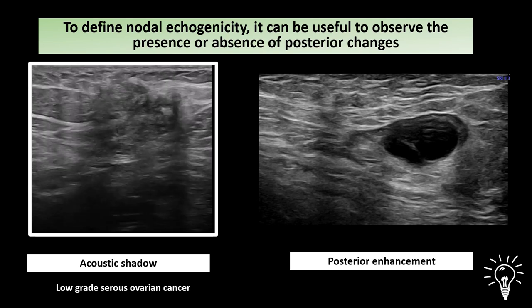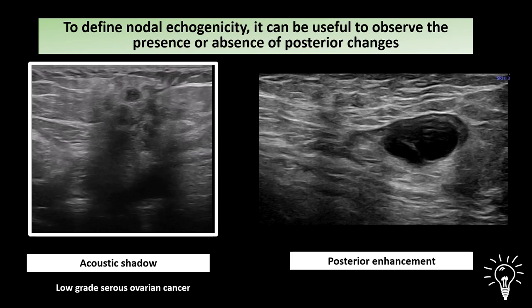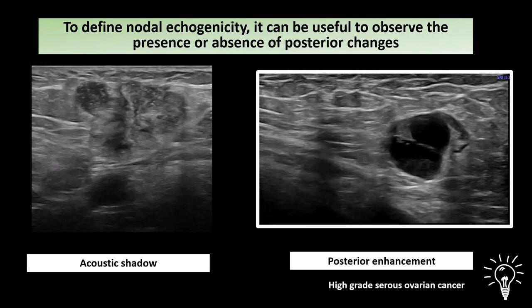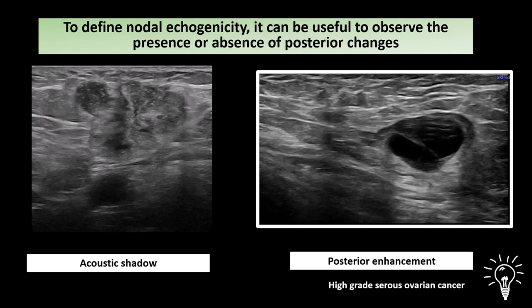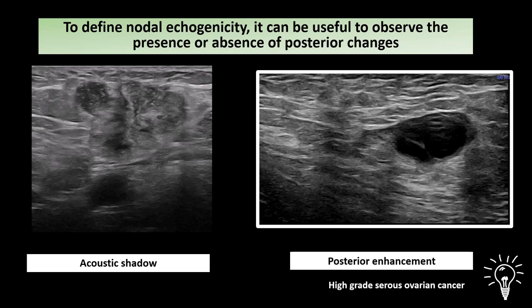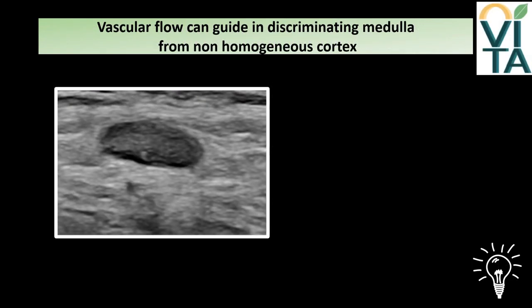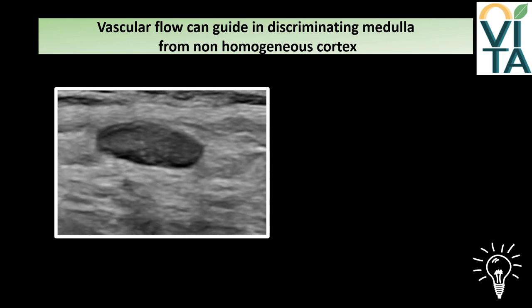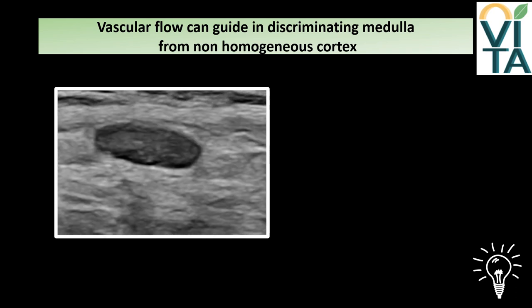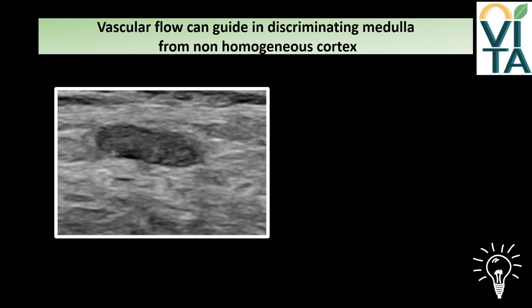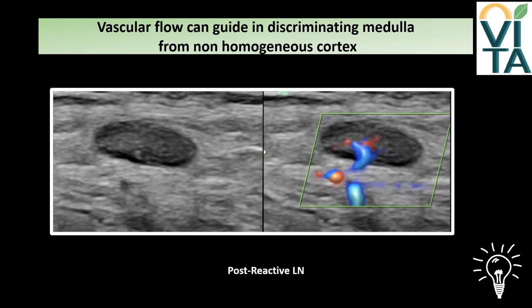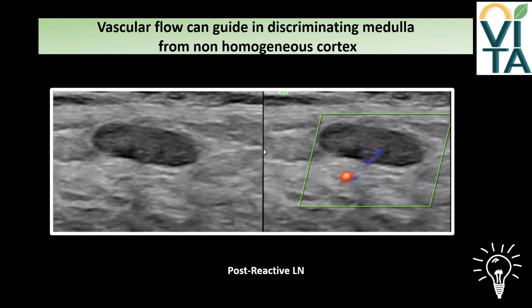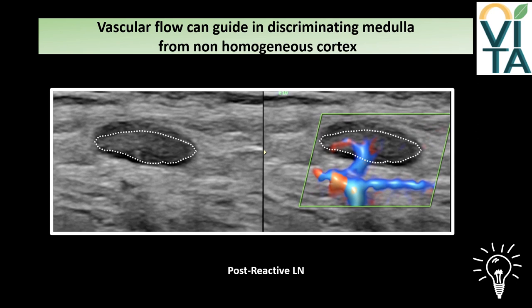To define echogenicity, it can be useful to observe posterior changes. An acoustic shadow is visible below calcification in this metastatic lymph node from low-grade serous ovarian cancer. On the right, posterior enhancement results from necrotic cystic areas due to infiltration from high-grade serous ovarian cancer. In some cases, distinguishing a completely non-homogeneous node from one with a not clearly visible medulla on grayscale alone can be demanding. However, switching on color Doppler allows identification of hilar vessels that guide attention to the center of the lymph node where a partial nodal core sign is present.